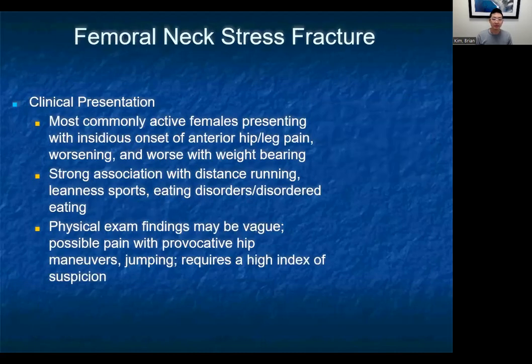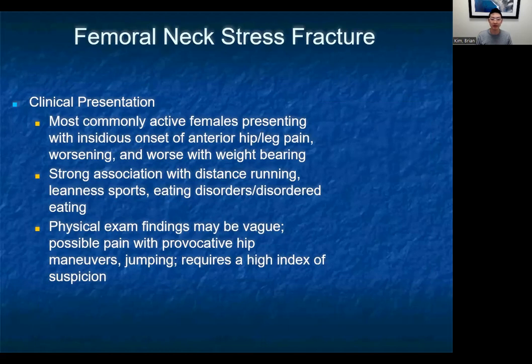Lastly, we'll talk about probably the most consequential stress fractures — femoral neck stress fractures. Clinically, these are most common in active females presenting with anterior hip pain, worse with weight bearing. There is a strong association with distance running, leanness sports including weight class sports, and eating disorders or disordered eating. A good history asking about components of the female athlete triad will be helpful. Physical exam findings may be vague, so imaging may be your best guide in many of these cases.